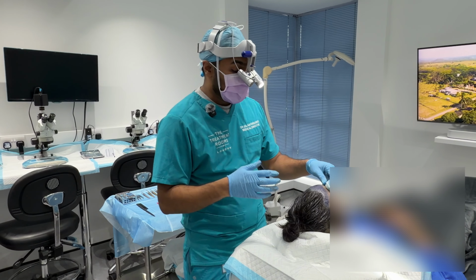Yeah, absolutely. So this is the hybrid approach that we tend to utilize here at the clinic. As you can see here, I'm using an implanter pen. This is what some people may know as, or may attribute to, a technique called DHI. DHI constitutes where the graft is loaded into the implanter pen. You can see the technicians doing that here for me. And in DHI, the needle is sharp and it can break the skin and deposit the graft into the scalp.